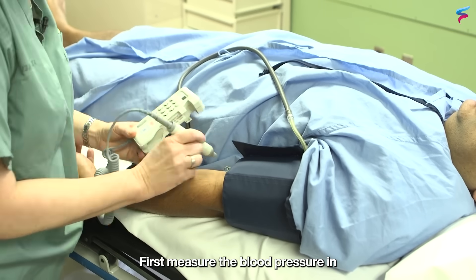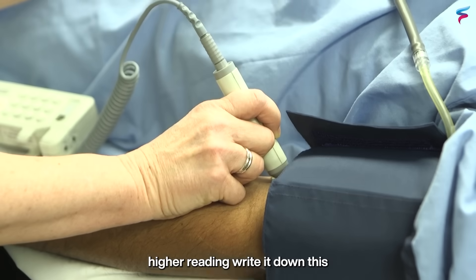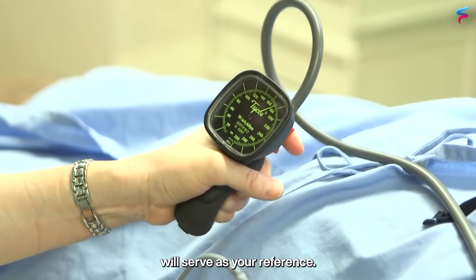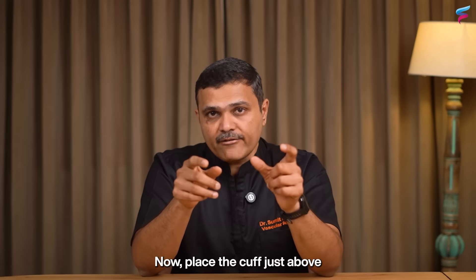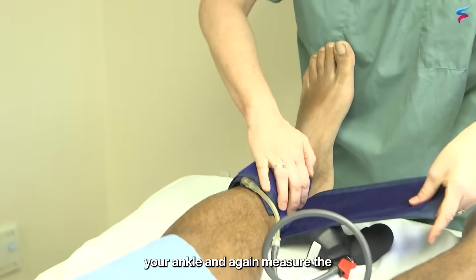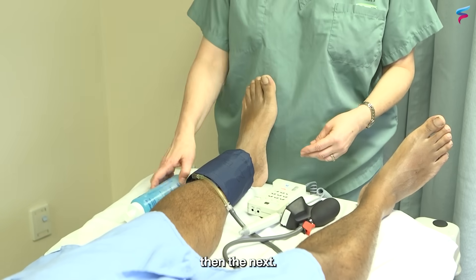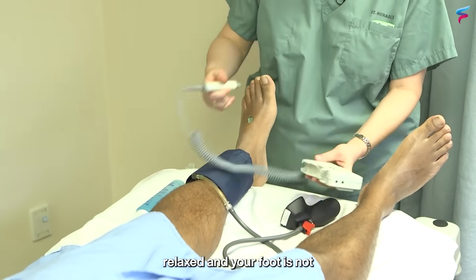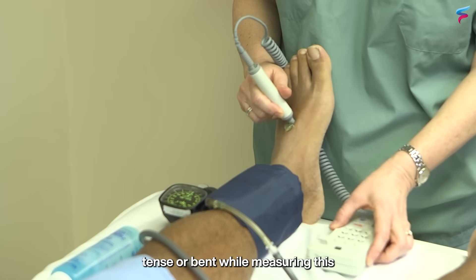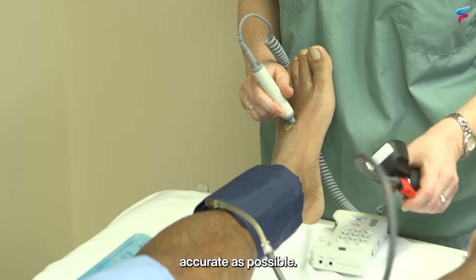First, measure the blood pressure in both arms and note the higher reading — write it down. This will serve as your reference. Now, place the cuff just above your ankle and measure the blood pressure in one leg and then the next. Make sure your leg is relaxed and your foot is not tense or bent while measuring. This ensures the reading is as accurate as possible.